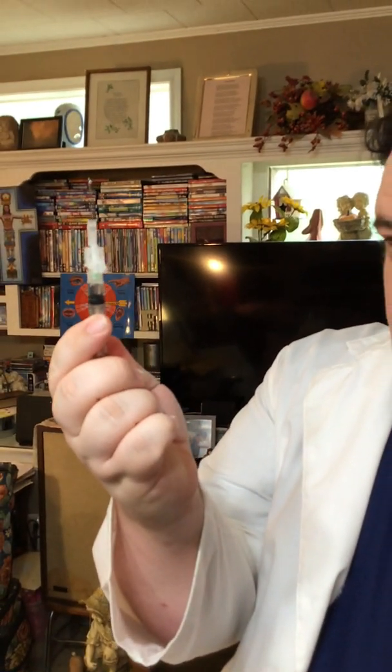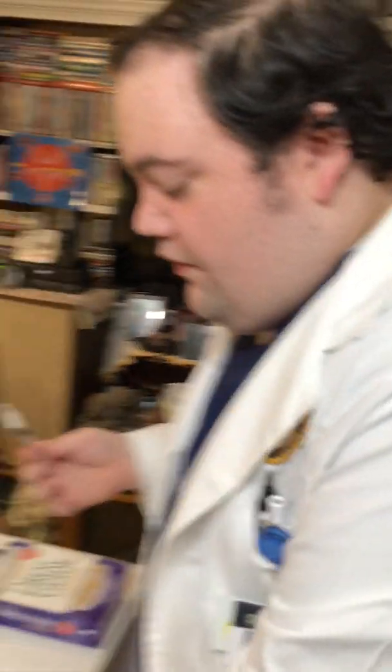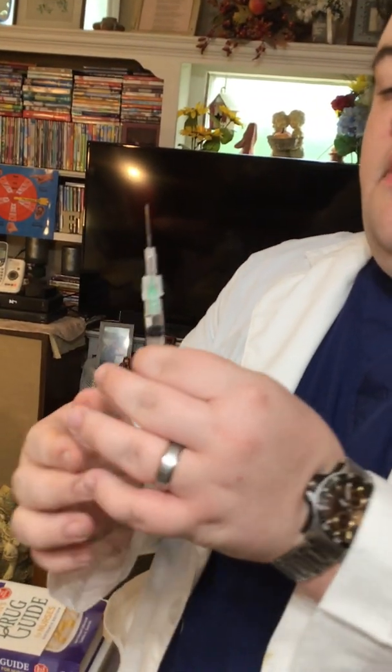You do not put air into the ampule. And the reason for that is, if you inject air into it, it will all come out and break the airtight seal. All right, we have 0.5 milliliters in this needle. We have all the air out.